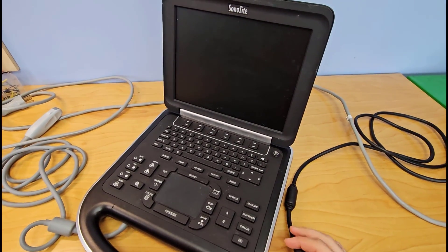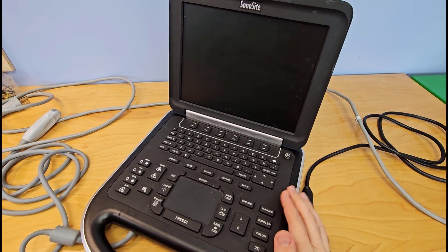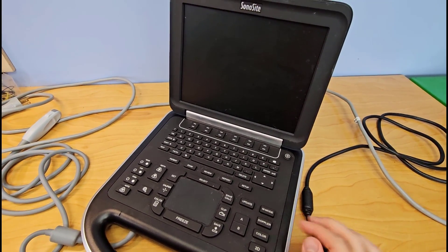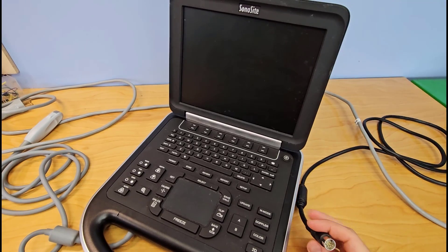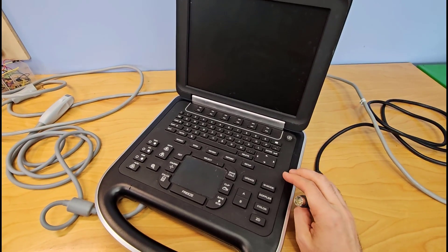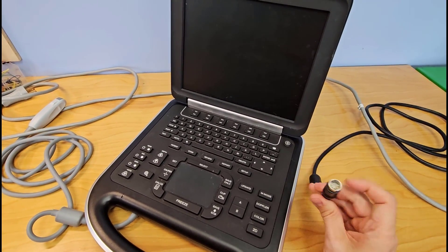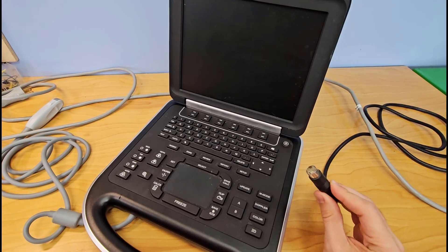This is a portable ultrasound machine and the company that makes this machine quoted $20,000 to replace the entire motherboard because the power plug is loose.